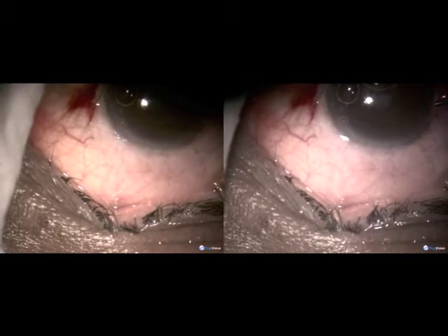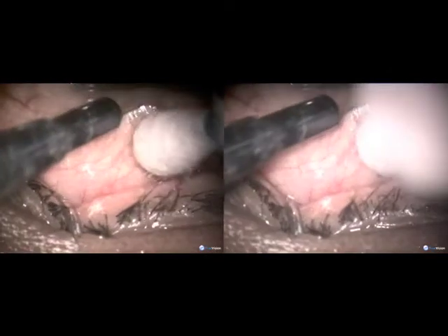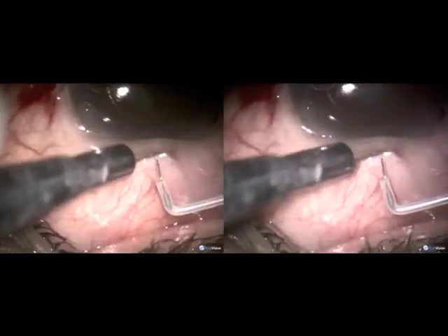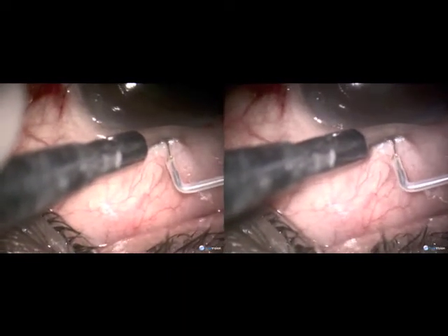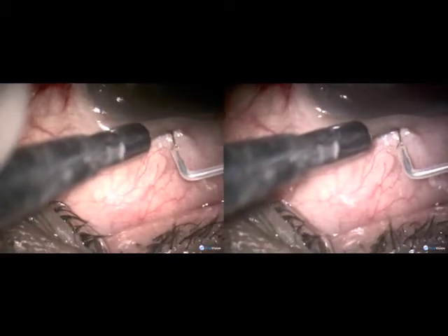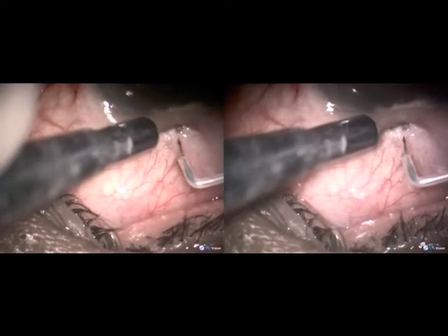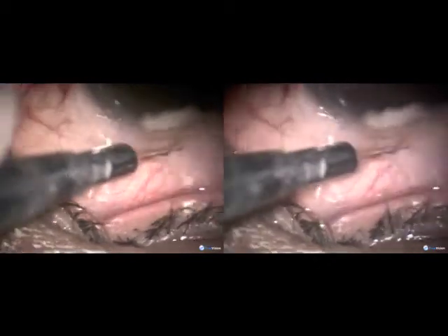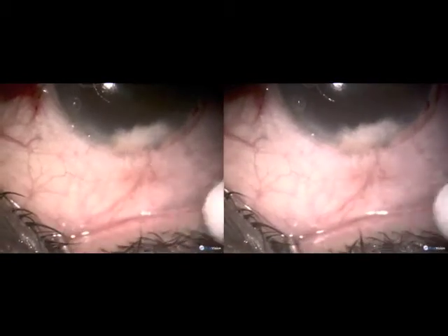The chamber is deepened with sodium hyaluronate, pushing the conjunctiva towards the limbus. Once in position, a 100-micron Fugo blade tip is used to make a tract through the conjunctiva, through the limbus, into the anterior chamber. Two such tracts are made — I like to make two microtrack filtrations — each one approximately 250 microns in diameter.